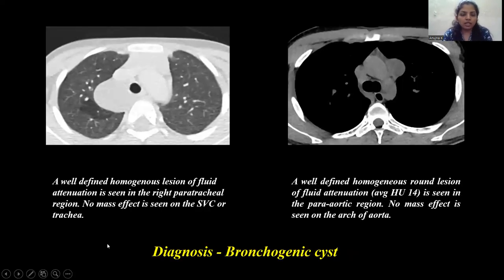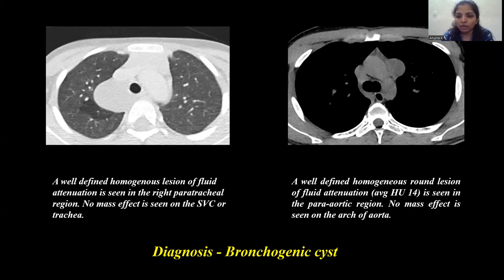This is an axial HRCT image showing a well-defined homogeneous lesion of fluid attenuation in the right paratracheal region, with no mass effect on the SVC or trachea. A similar case shows a homogeneous round lesion of fluid attenuation in the paraaortic region, with no mass effect on the arch of aorta. These cases were diagnosed as bronchogenic cysts.